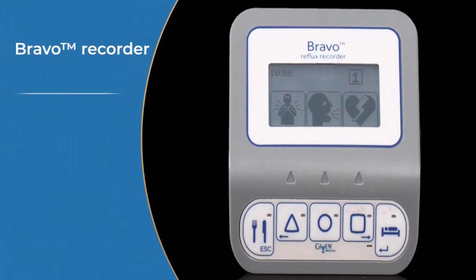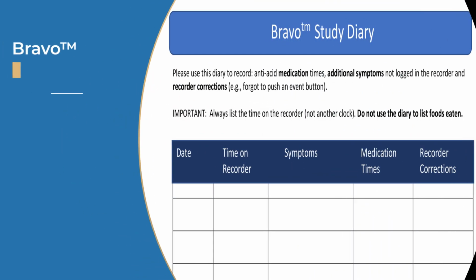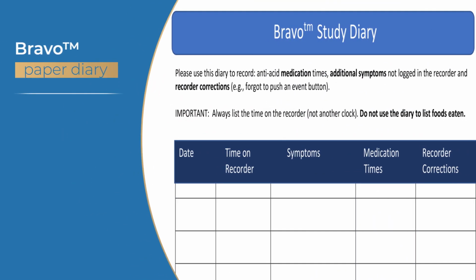This is the Bravo recorder, and this is the paper diary that you'll also use to record certain events. In this video, I'll show you how to record eating, lying down, and symptoms. I'll also show you how to use the diary and how to return the Bravo recorder. First, let's learn how to record eating, lying down, and symptoms.